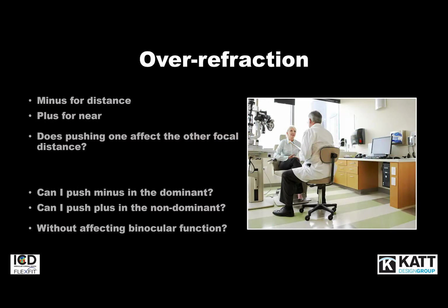Over-refraction is always an important part in any contact lens, and especially a multifocal lens. The same rules that you apply for any multifocal lens would apply for the ICD FlexFit Multifocal. Let's look at pushing minus if we need to improve distance, pushing plus if we need to improve the near. If we increase the minus, does that affect the near? If we increase the plus, does that affect the distance? So all of the usual considerations.